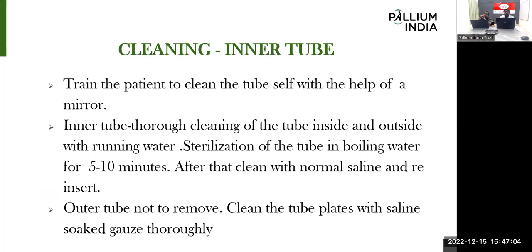According to the tube setting, they unlock and take out the inner tube, then clean it under running water, both outside and inside.